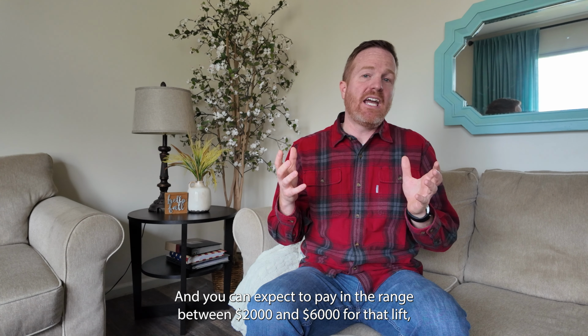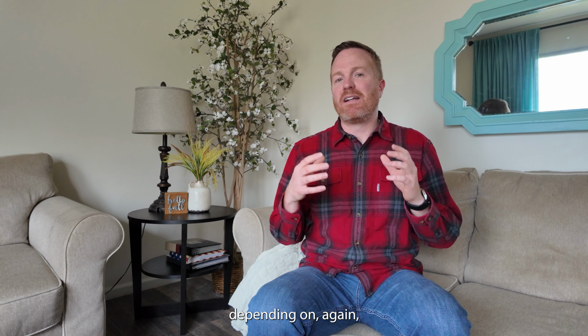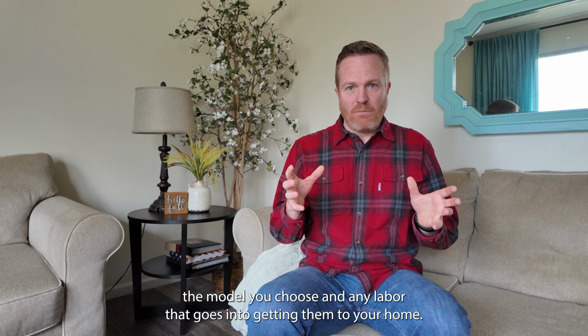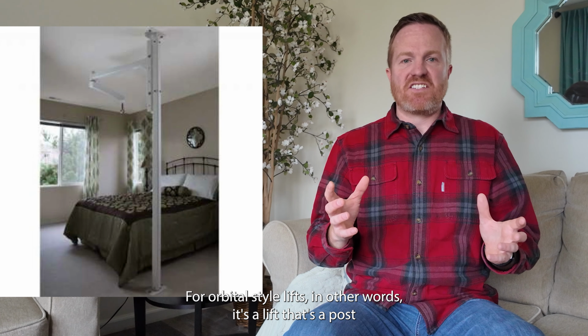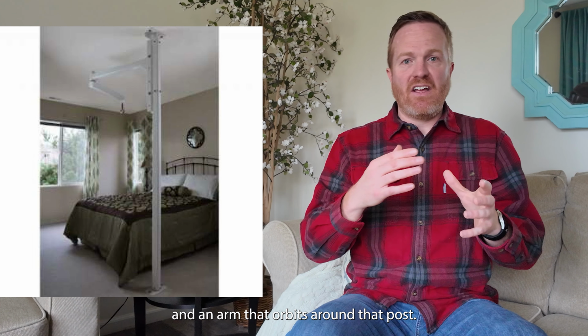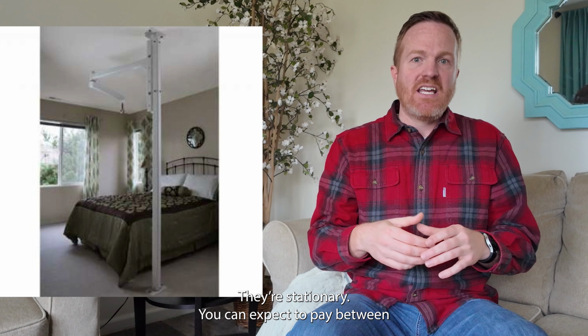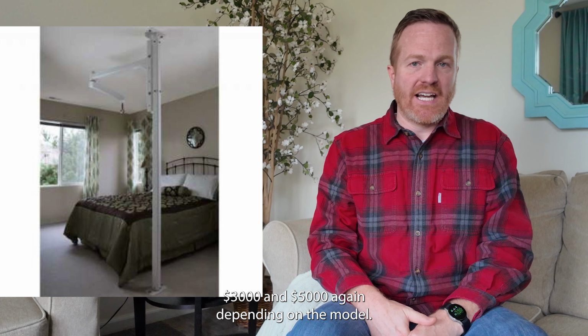And you can expect to pay in the range between $2,000 and $6,000 for that lift, depending on, again, the model you choose and any labor that goes into getting them to your home. But it is very much less labor intensive than a ceiling mounted lift. For orbital style lifts, in other words, it's a lift that's got a post and an arm that orbits around that post, they're stationary, you can expect to pay between $3,000 and $5,000, again, depending on the model.